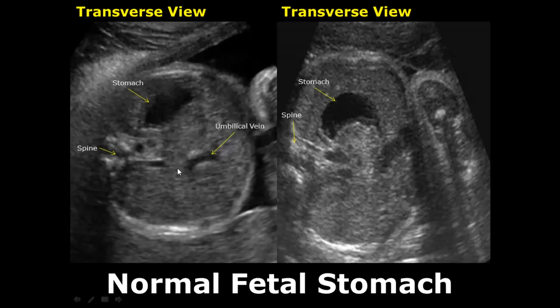The filling of the stomach depends on the swallowing of amniotic fluid by the fetus. Here we can see the umbilical vein and here is the stomach. And here is the spine, hyperechoic, with shadowing.